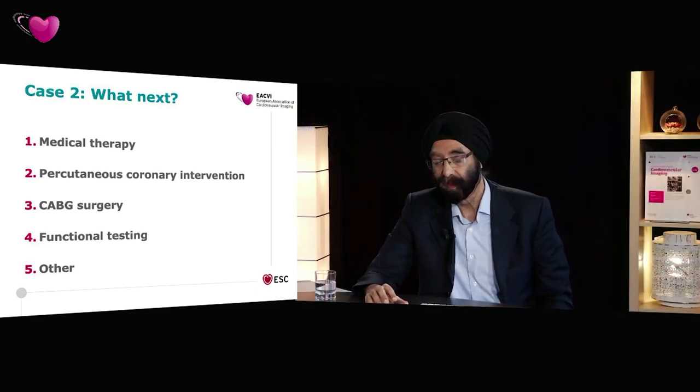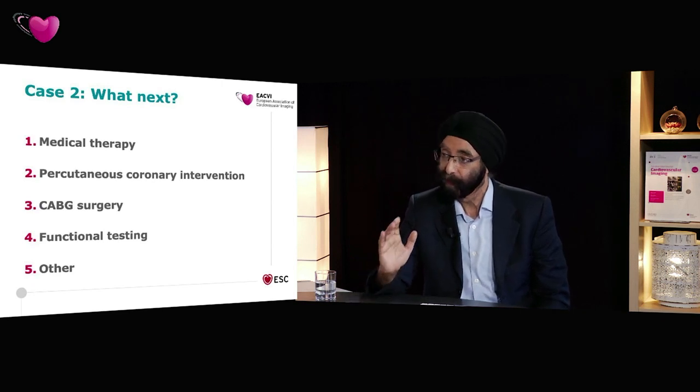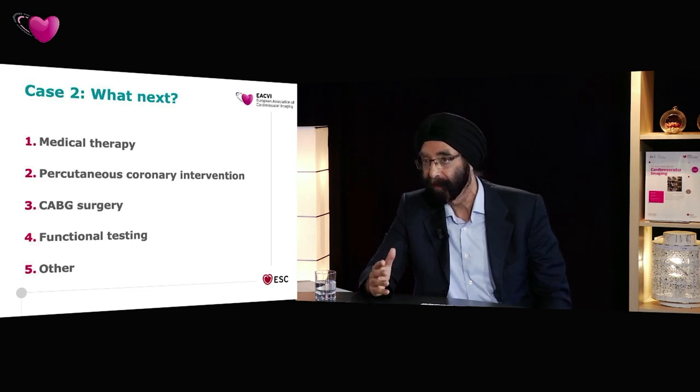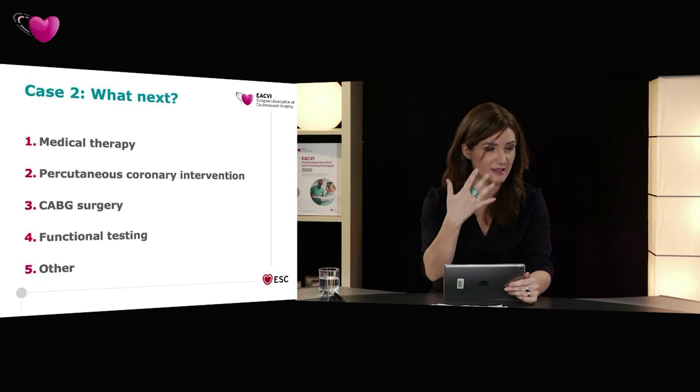But I think contrast is very good for looking at the apex. And I can show you examples where there's a lot of trabeculation at the apex. The 2D images are great, but you don't see the true compacted myocardium. So I think if in doubt, use contrast, and certainly have a low threshold for using it, because it also helps a lot with the interpretation of wall motion abnormality, and we know that from previous studies. Also, you can foreshorten the pictures a little and then you cannot see the true apex, while with the contrast you are better oriented, I believe.